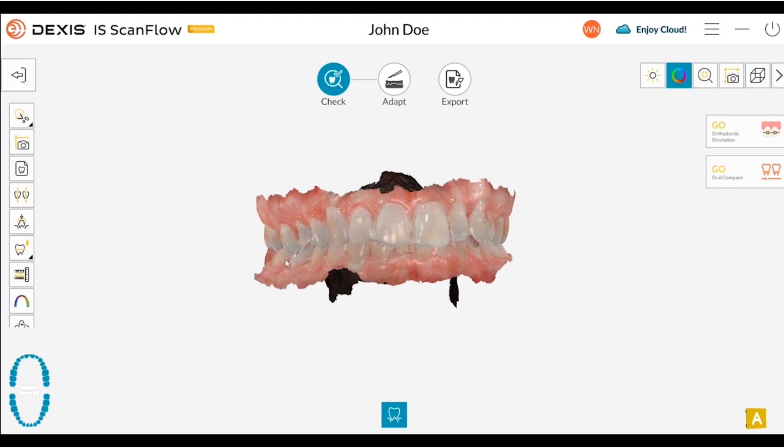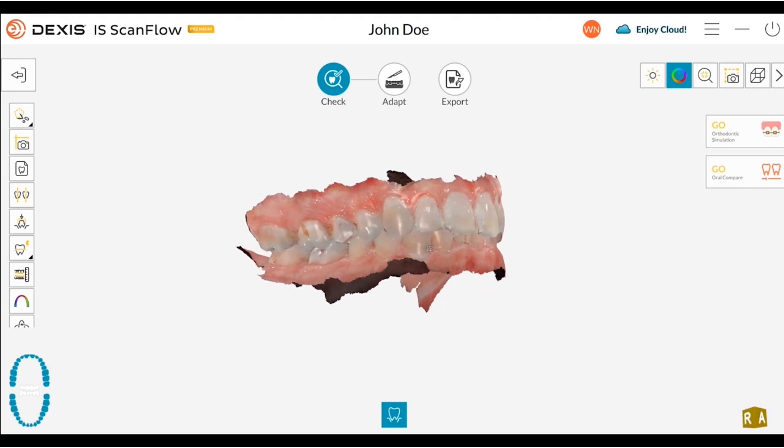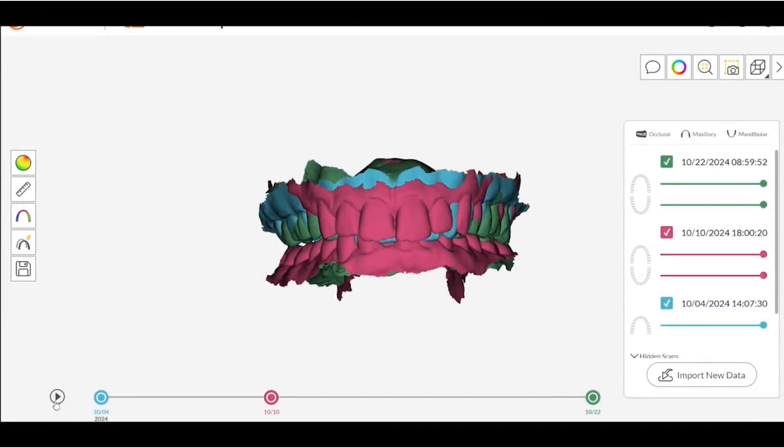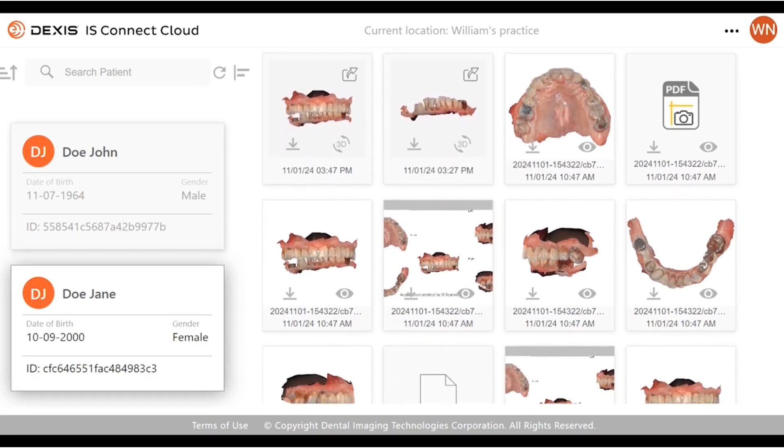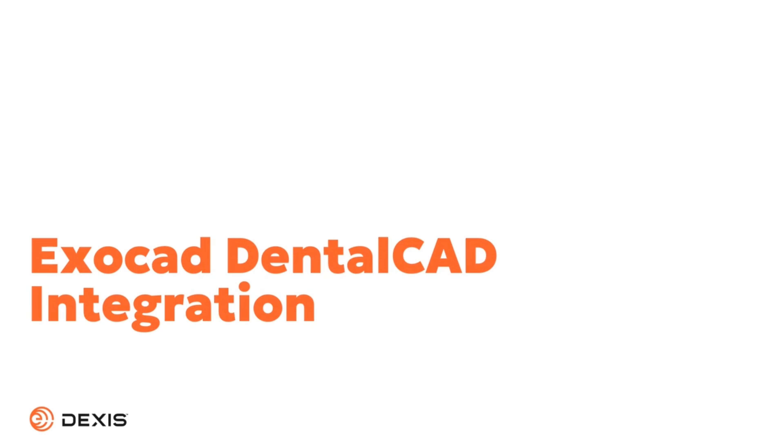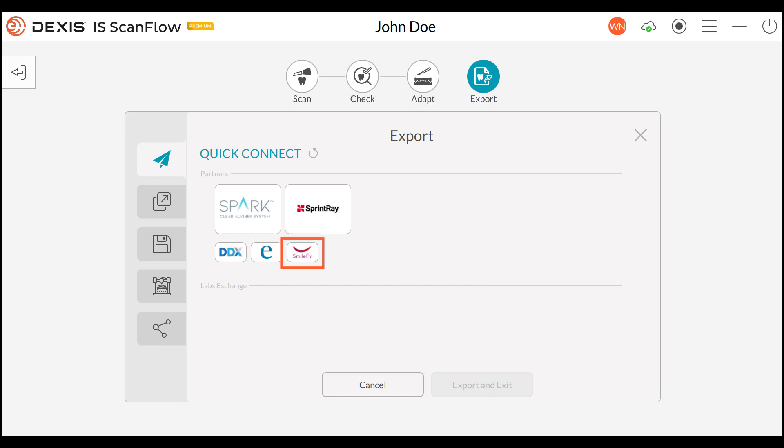Improvements to scan quality and the user experience, oral compare, Dexis IS Connect Cloud, integrations with ExoCAD to streamline the lab workflow, and an integration with SmileFi.